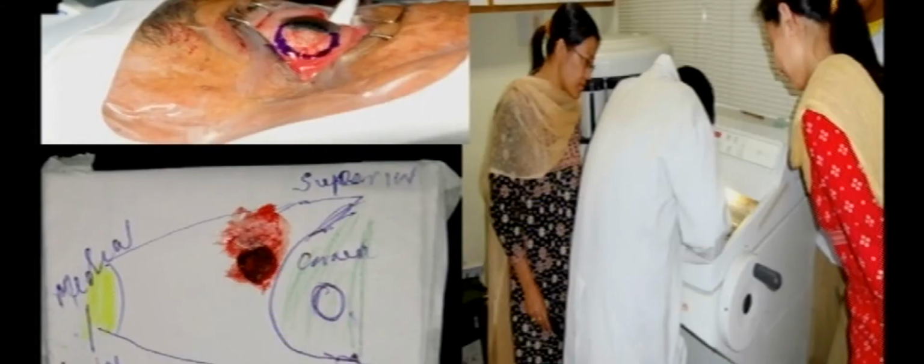Again, what Tarjani and Anusua showed, the keratin. I have seen this just a month back. This is obvious keratin, and you have to think of it as squamous cell carcinoma. You have to do a frozen section biopsy for the margin clearance in this.